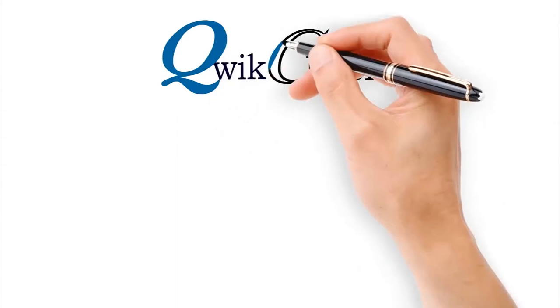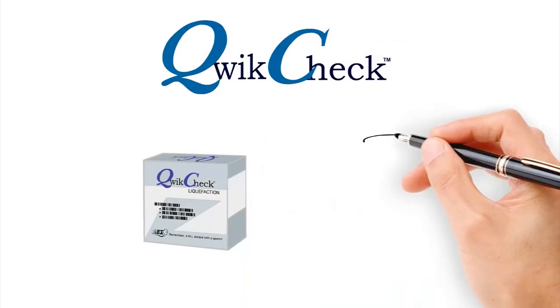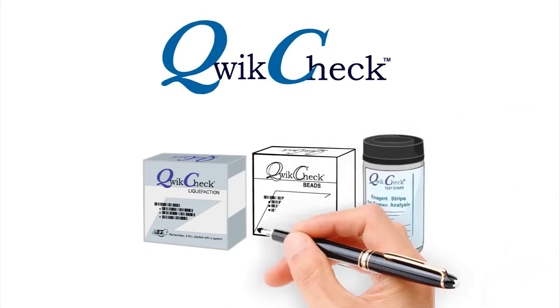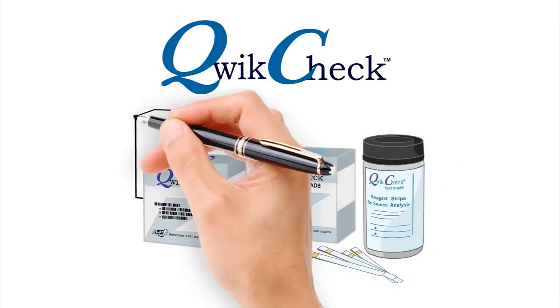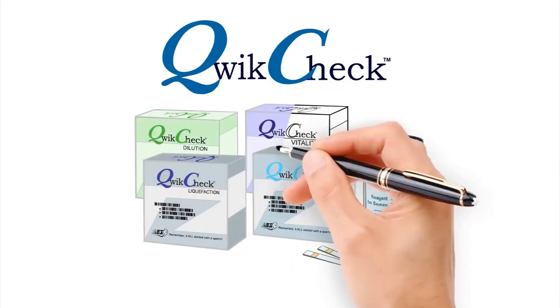Related quick check test kits include a liquefaction kit to liquefy viscous samples, WBC pH test strips, three-level quality control beads, motility-preserving dilution media, fixed cover slip slides, and one-step vitality stain.